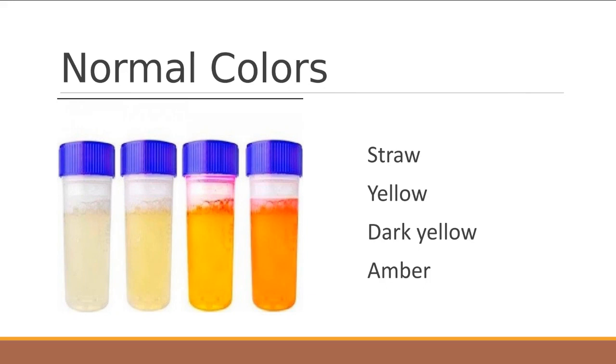Your amber color, it's a little harder to determine what it looks like on the screen, but amber colored urine looks a lot like tea. If you look at table 5.1 in your book, it shows you laboratory correlation of urine color and gives you some abnormal colors also. Abnormal colors can be indicators of a pathological condition, or they can also be from different medications that a person may be taking. Remember the 3 Uro definitions that I gave you to look at.